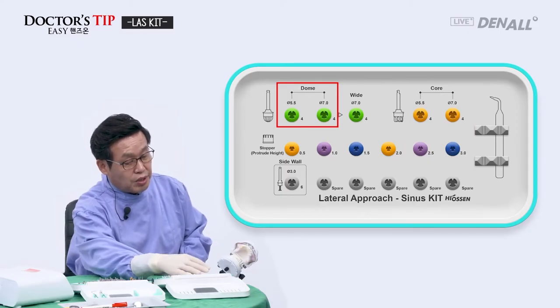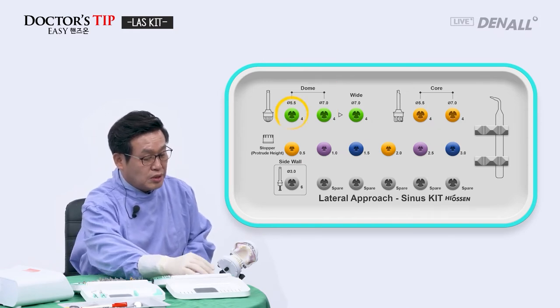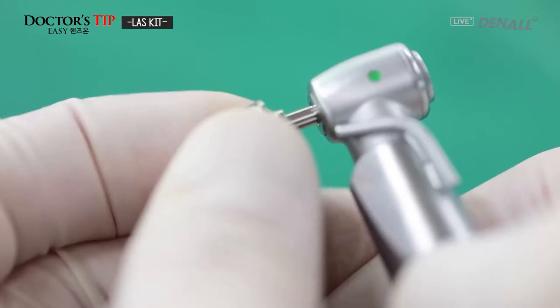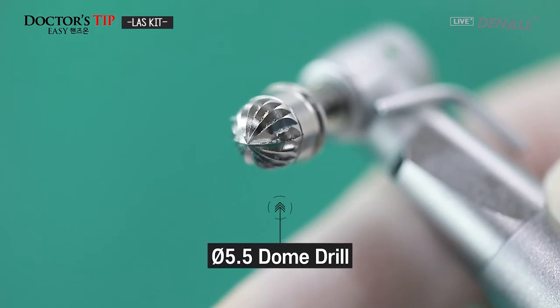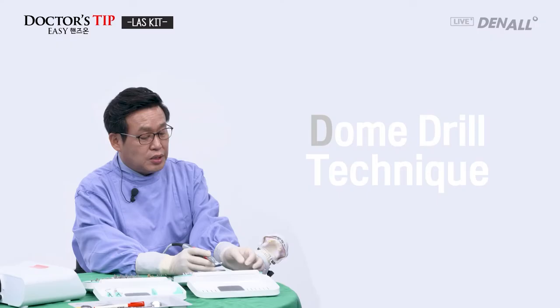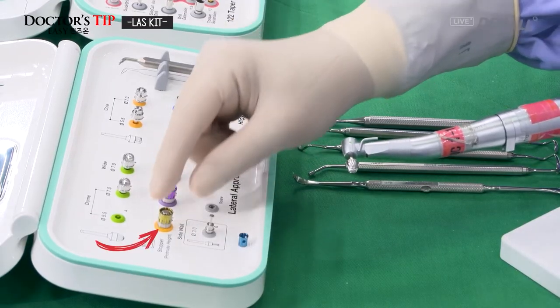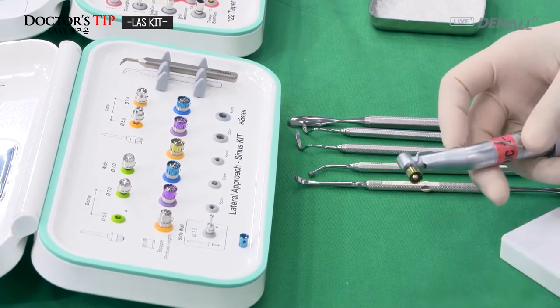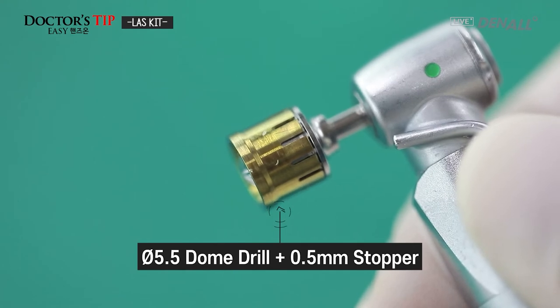For the dome drill diameter, you have 5.5 and 7.0. So first I use the 5.5 and then use the 7.0. There are two dome drills, 5.5 and 7.0. I'll use the 5.5 first with the stopper. Like this, that is 0.5 millimeters. With a 0.5 millimeter stopper, the blade is not very visible because it's too short.